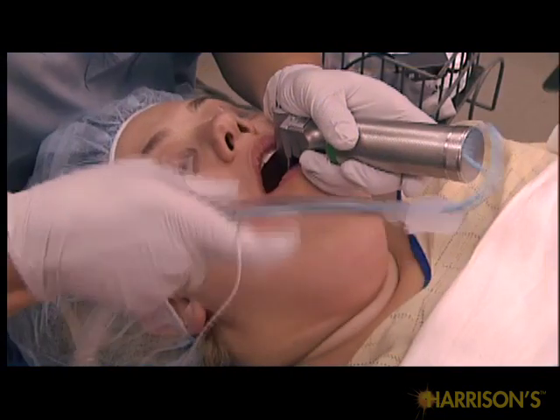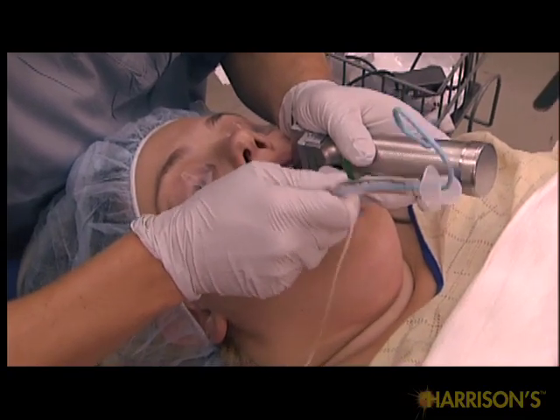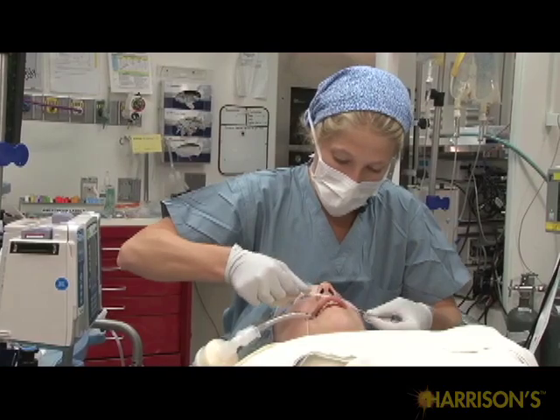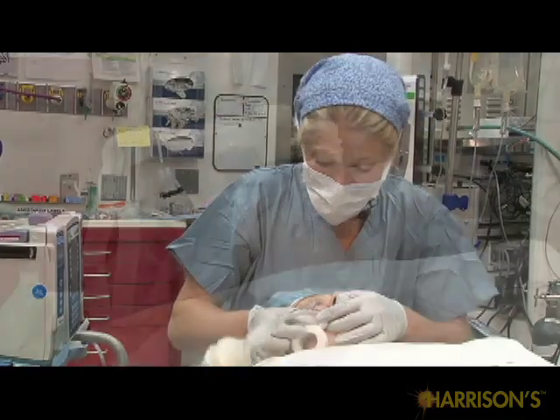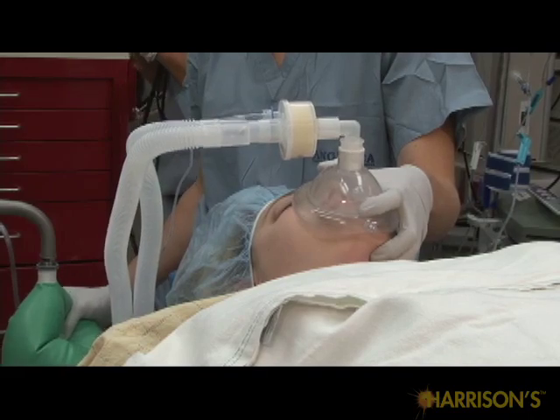epiglottis. Once the vocal cords are visualized, the styleted endotracheal tube is passed through the vocal cords and the cuff is inflated. Confirm proper position of the endotracheal tube. And once proper position is confirmed, secure the endotracheal tube. Bag ventilate any patient who is difficult to intubate and immediately call for help.